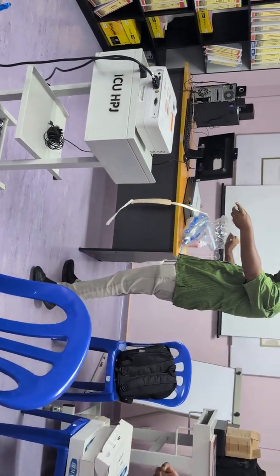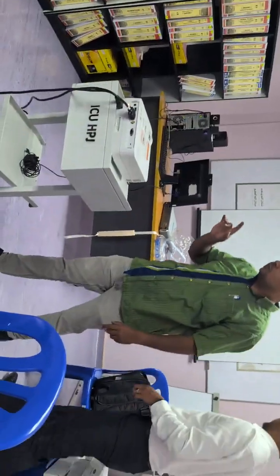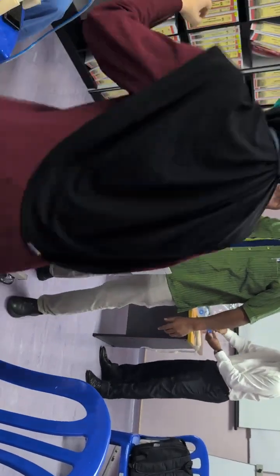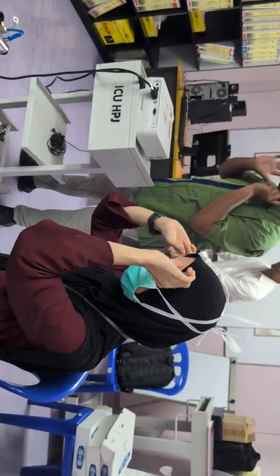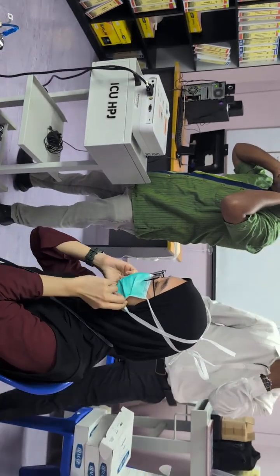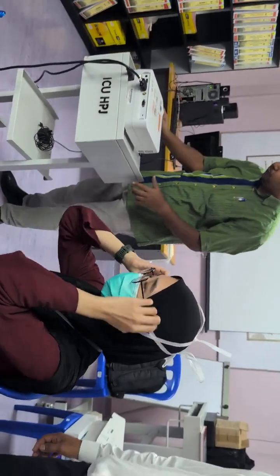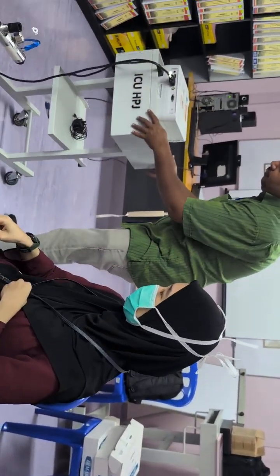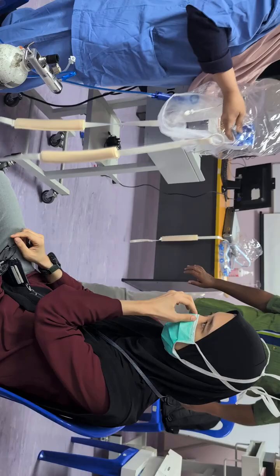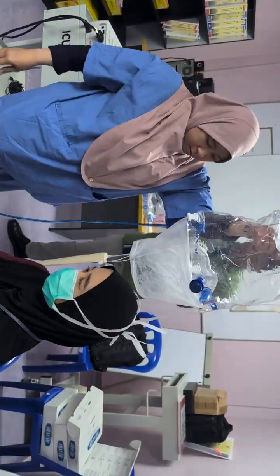You want to try the CPAP one? Now, you see, doctors, very importantly, I'm telling you, okay? This is to come in contact with the skin. I'm going to show you how it's going to work with the volunteer. Doctor, be very careful. So, doctor, this is a CPAP mask.